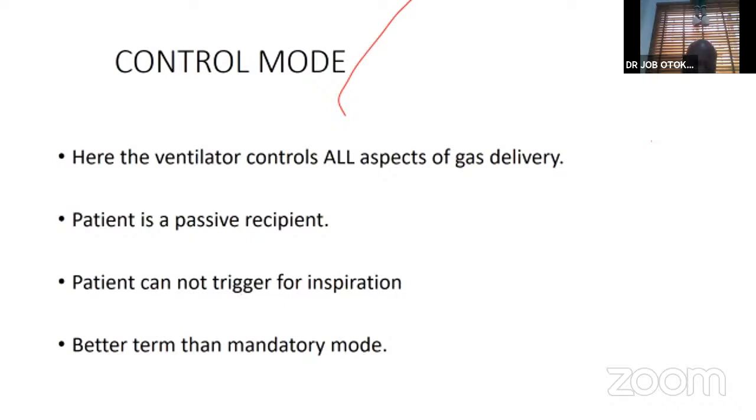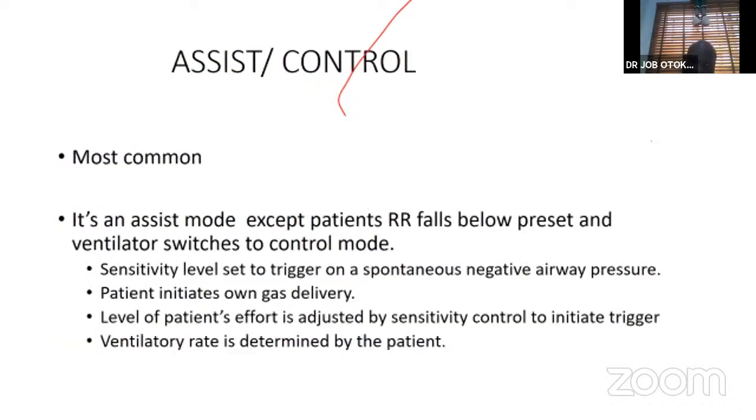So I've talked about the control. I've talked about the assist control, which is the most common, that SIMV that I often use. I will say the patient makes effort, then the machine adds some mandatory breaths and also supports the efforts that are made by the patient.